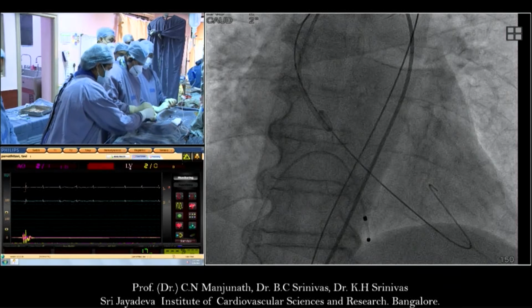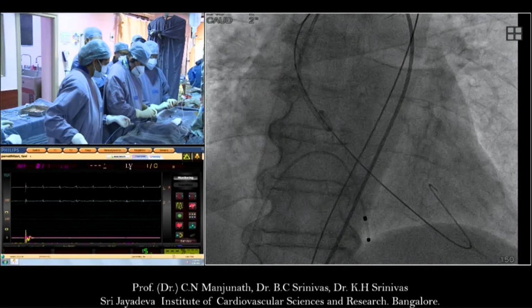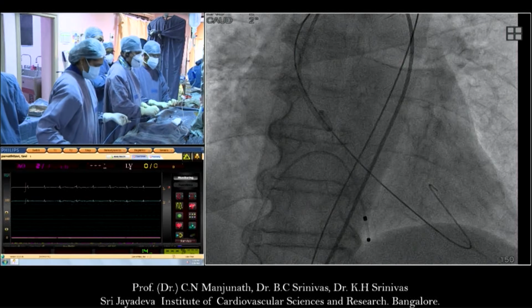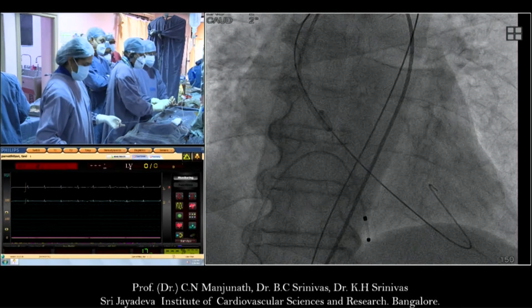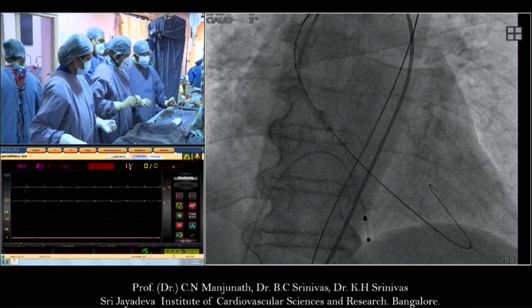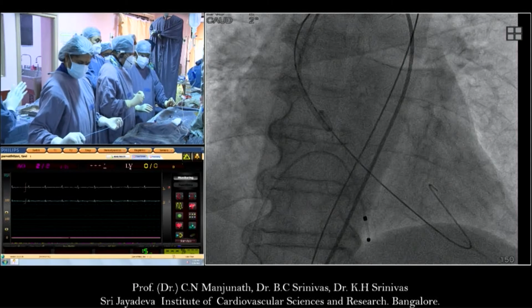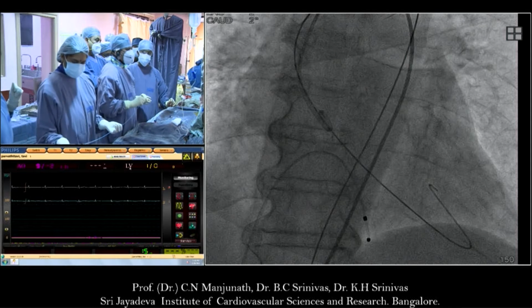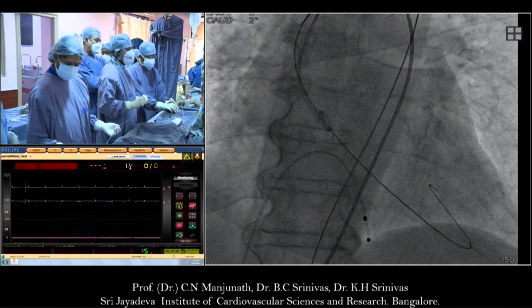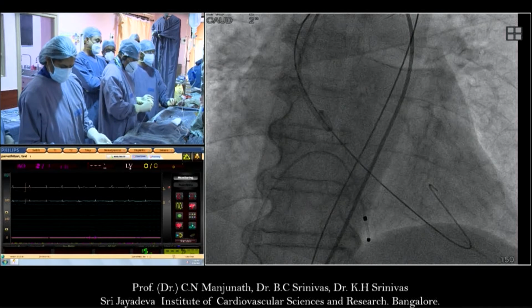Yeah, that's a very good strategy, especially to make sure the wire is not getting caught in the mitral apparatus, especially if you don't use TE. Yeah, correct, I think it's the best practice. The wire should not get caught. Otherwise, the LV cavity in aortic stenosis invariably is small, so if you don't take this precaution, it can perforate the LV.